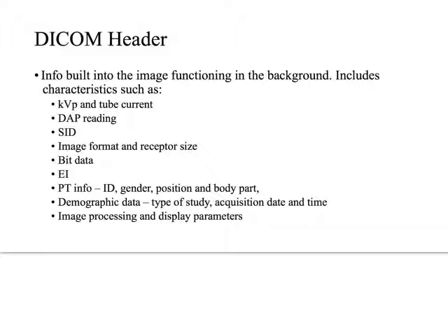So it's a powerful format, and we don't fully exploit everything about it. I think earlier when we were talking about what are some of the things that you think will happen in the future, I think some stuff will start to happen around exploiting this data that's embedded here in DICOM files. I think in particular managers could use this data to further guide process improvements in workflow, reducing patient dose and improving equipment usage and reducing cost.